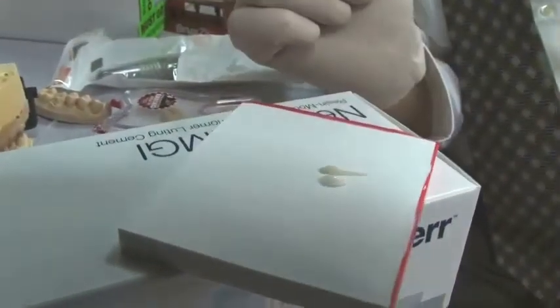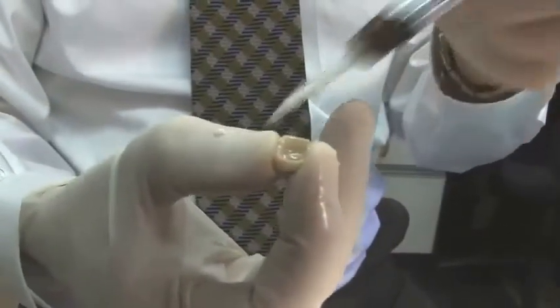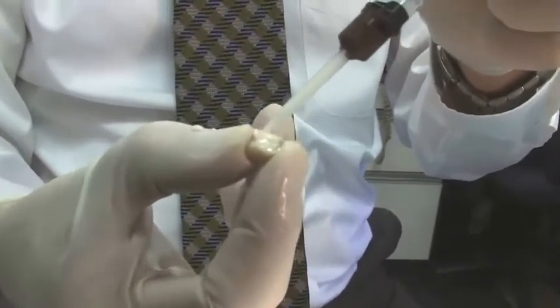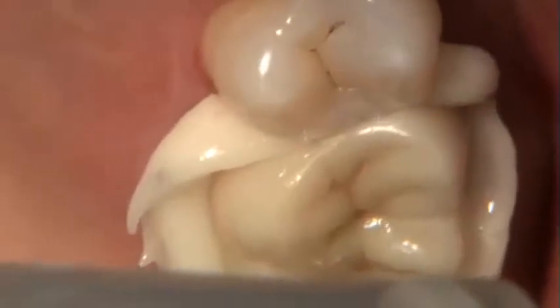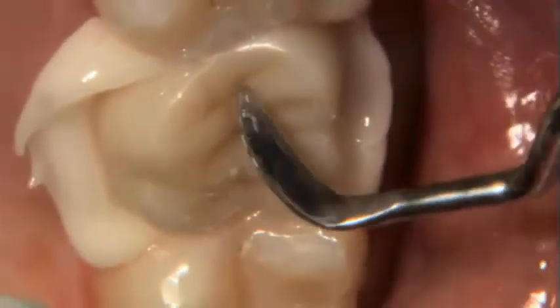I'm going to bleed the syringes of the Nexus RMGI just to make sure there's no blockage. This is the ease and convenience of a dual barrel auto mix system — I just squirt a little out onto my thumb to make sure we've got good patency. Then I'm going to place the cement in the crown. The auto mix gets rid of the days of powder and liquid, chilled glass slabs, spatulas, and all that mess.